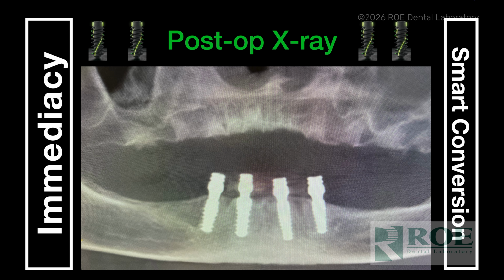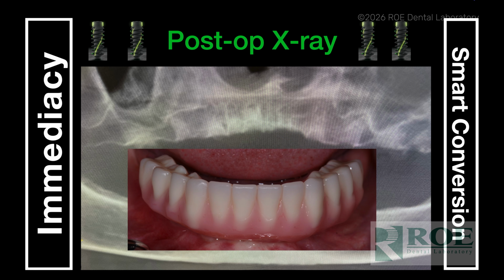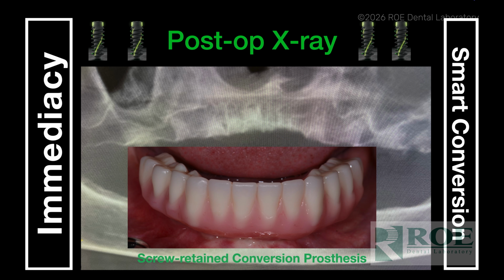And here's our post-surgical Panorex. And you can see how we would be placing our MUA abutments with angled abutments in the distal and picking up our prosthesis using that smart conversion technique.